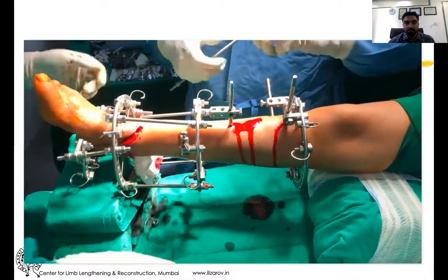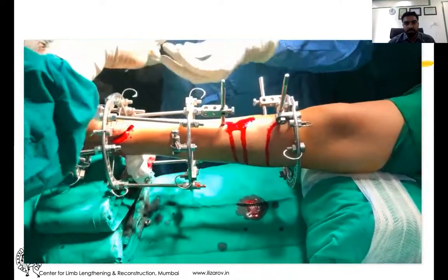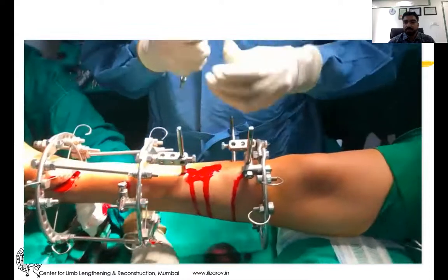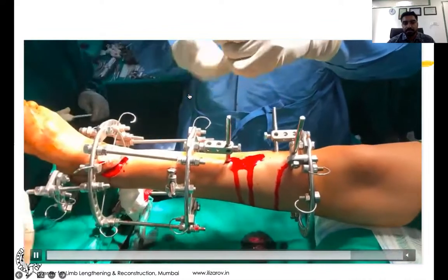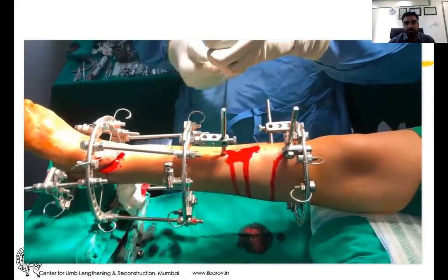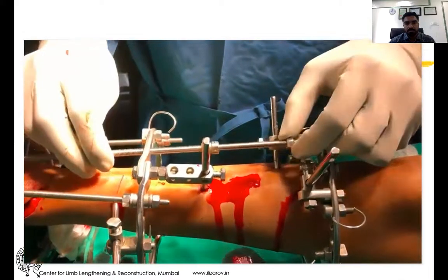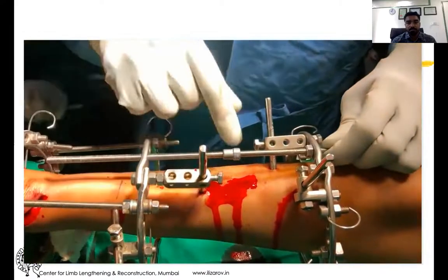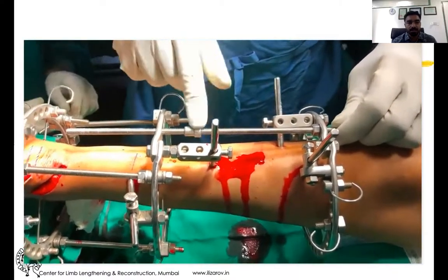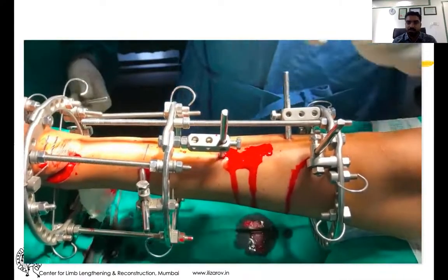Then you can reapply the rod, and just skin sutures are sufficient. This demonstrates the complete corticotomy proximally. Similarly, you can perform it at the distal tibia, proximal femur, or distal femur.